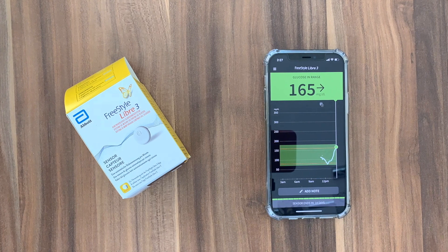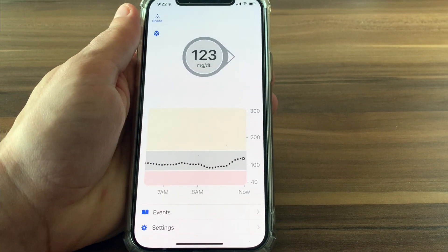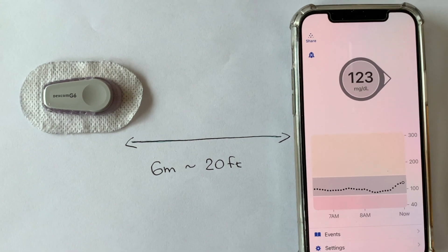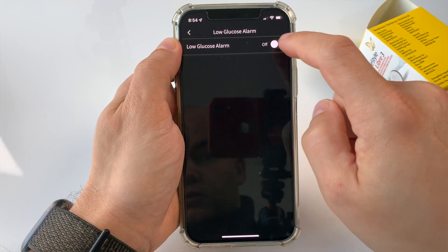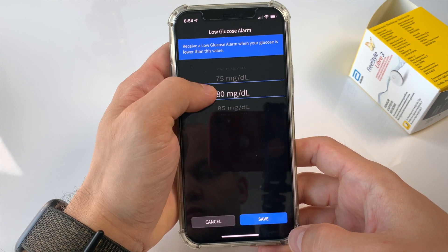Next I want to talk about Bluetooth connection reliability and alarms. The data is sent from both of these sensors to their respective receiving devices automatically via Bluetooth. From my experience when using a phone as the receiving device, the reliability of both sensors and the reach of both of them is fairly similar and comparable. None of them is perfect — both Libre 3 and Dexcom G6 lose connection from time to time. But as long as you keep your phone in the same room where you are, the data transfer is fairly smooth. Both systems have customizable alarms and they will alert you when your glucose is too high, too low, or when your device loses connection from the sensor.